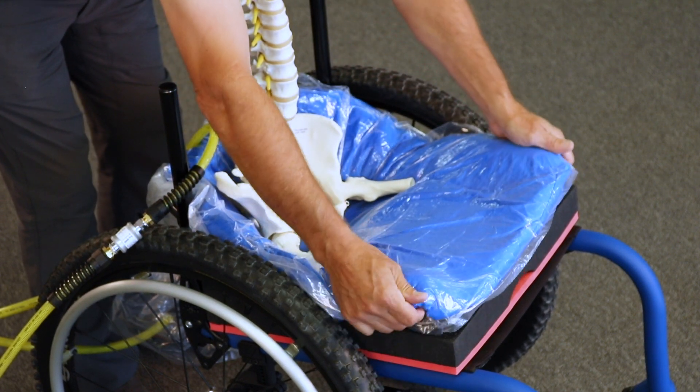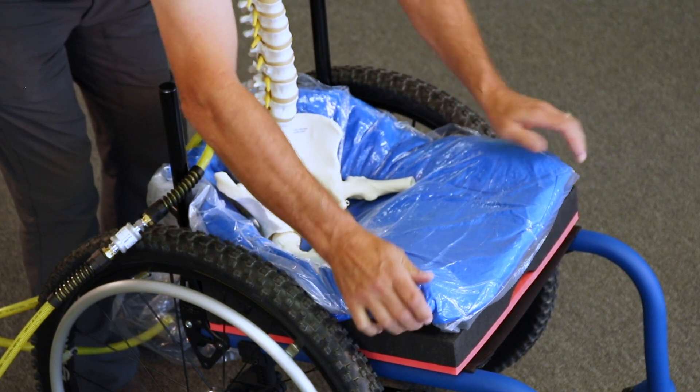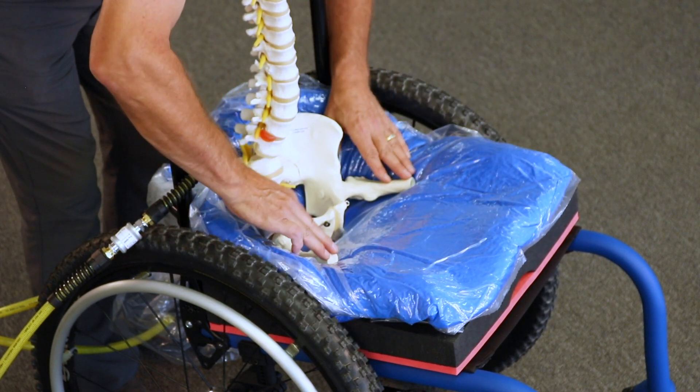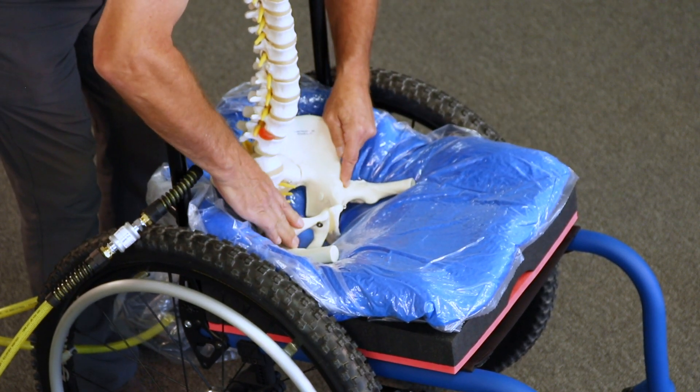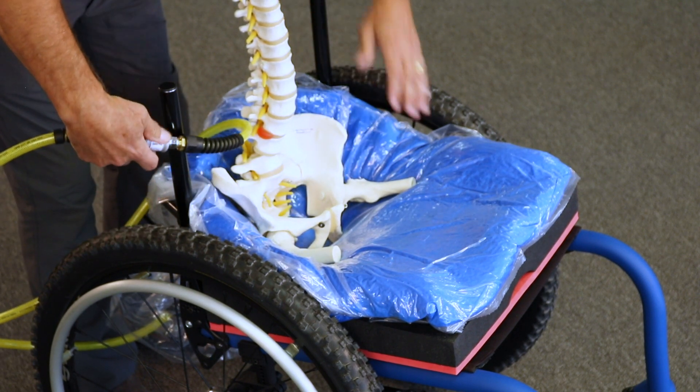Here's where, if I want to influence the lateral thigh, I always want to lift and roll the bag. You don't want to push that in — lift and roll the bag. Once we have everything set in place, we go ahead and lock the bag down at that point.